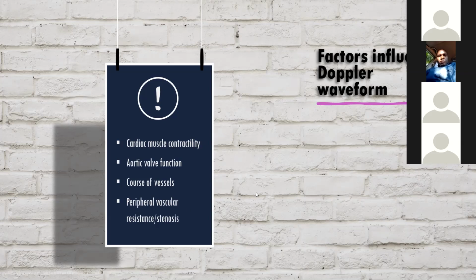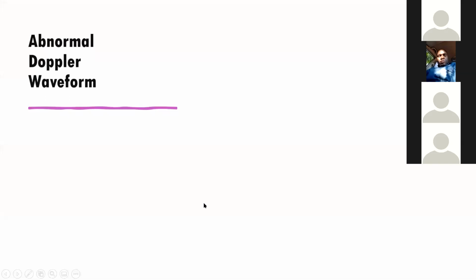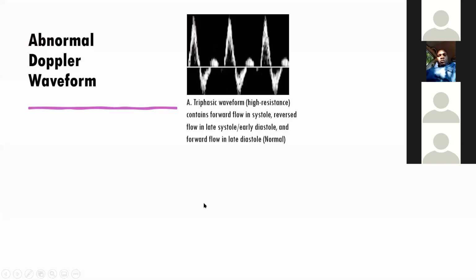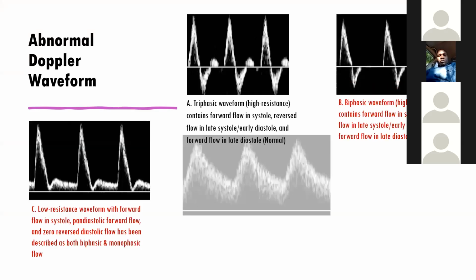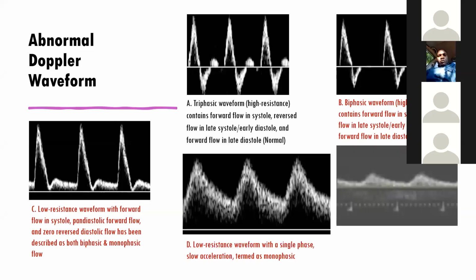Okay, so now we need to check about abnormal Doppler waveforms, and I am presenting here all the abnormal waveforms that will be just helpful for us to identify.